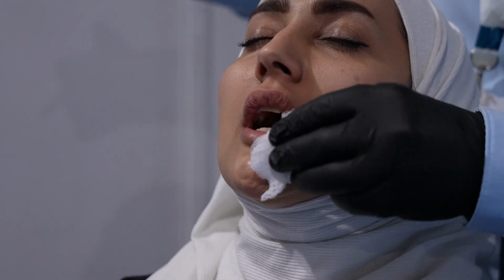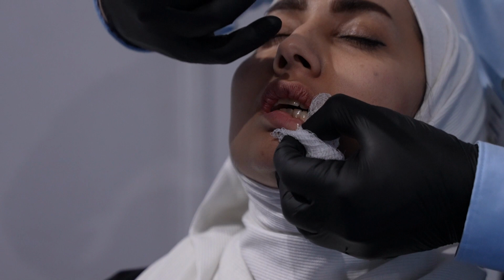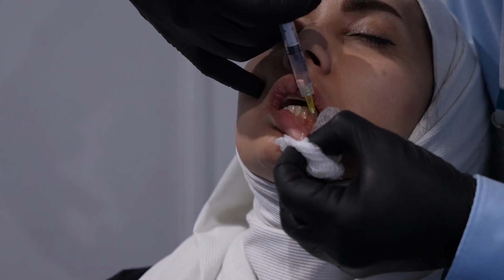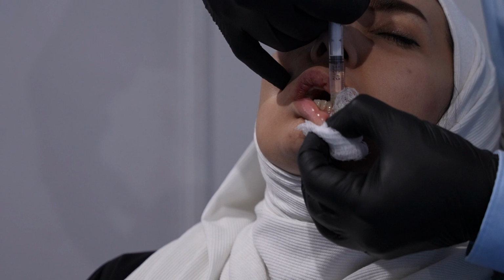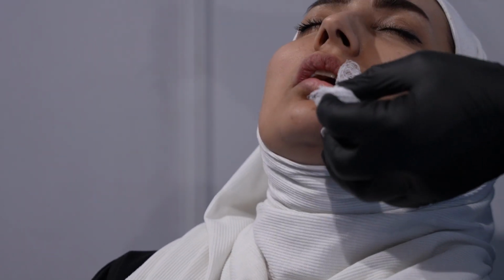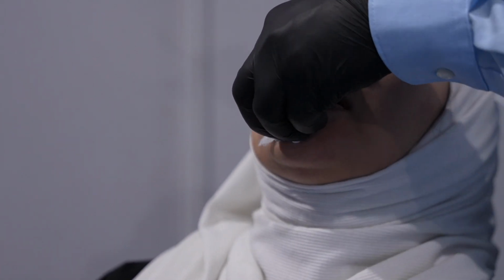This for the lower lip, the same. We will just retract and go forward to see the apex of the vestibule and inject toward it, usually 0.5 to 1 cc. Of course, yes, the xylocaine.